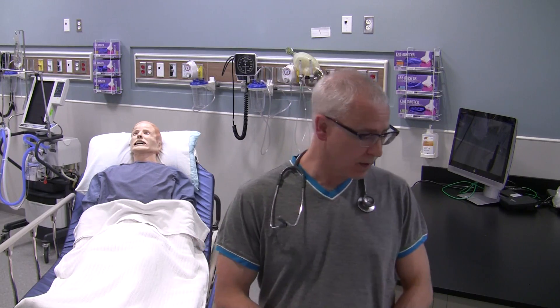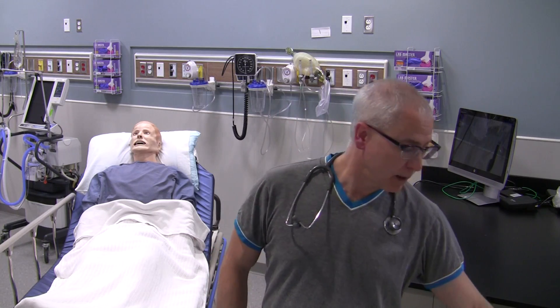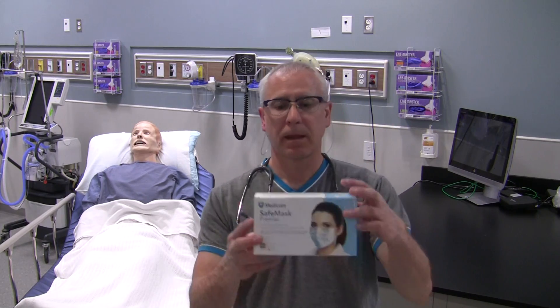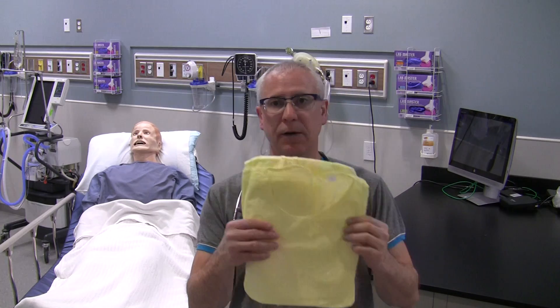If you need to do gastric tube insertion, you're going to need some supplies. A lot of this is self-explanatory. First, your PPE — wash your hands and don the appropriate personal protective equipment required for the procedure. Follow the protocols in your hospital or wherever you're working. Make sure you're using gloves; you don't need sterile gloves unless done with sterile technique — typically it's a clean technique procedure. Grab your gloves, a mask to protect yourself from secretions, possibly a mask with a face shield, and a gown for yourself as well.